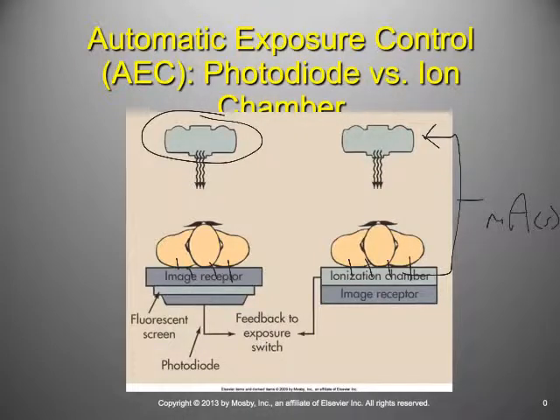A similar process can happen inside of our CT machine, but just bear in mind I am talking about something separate from the X-ray circuitry right now. I'm talking about something that happens after the X-ray tube has fired off a beam of X-rays, and the X-rays have attenuated within the patient and are now exiting the patient.